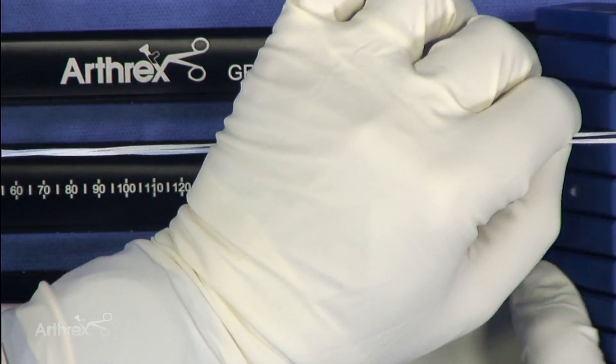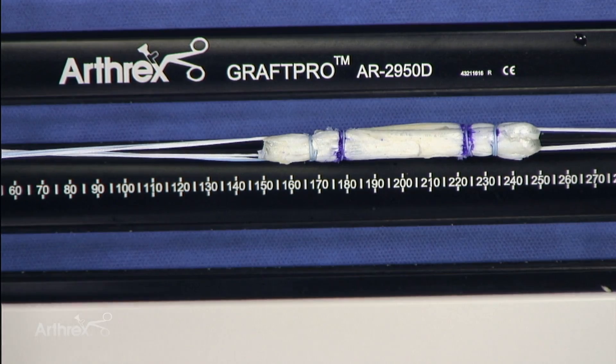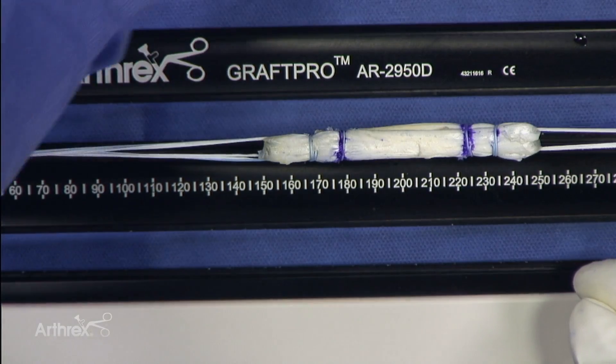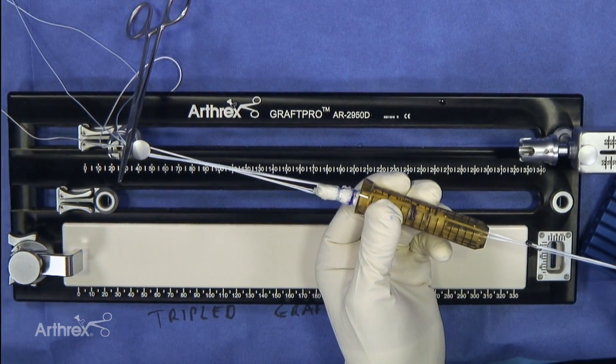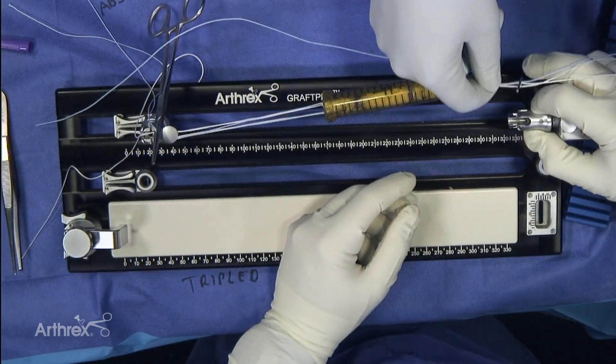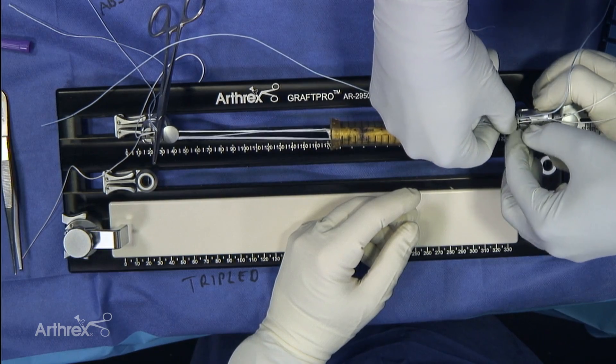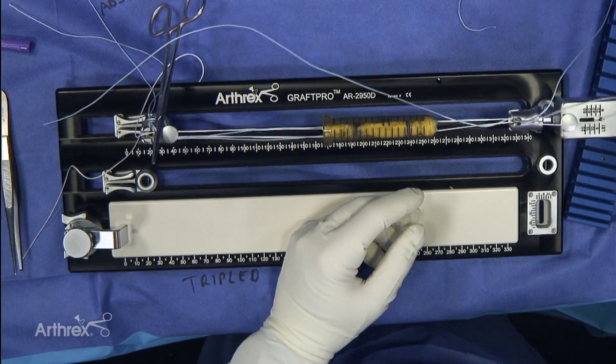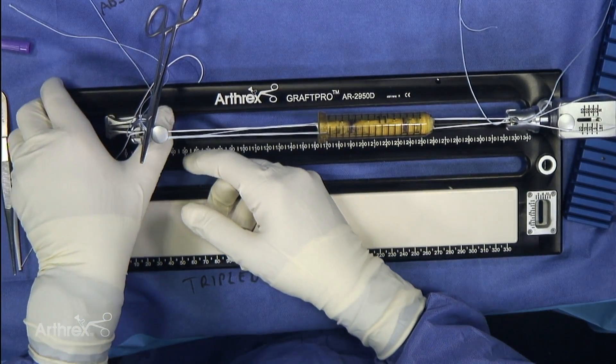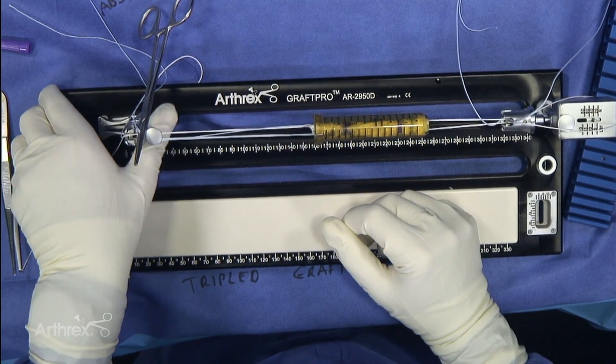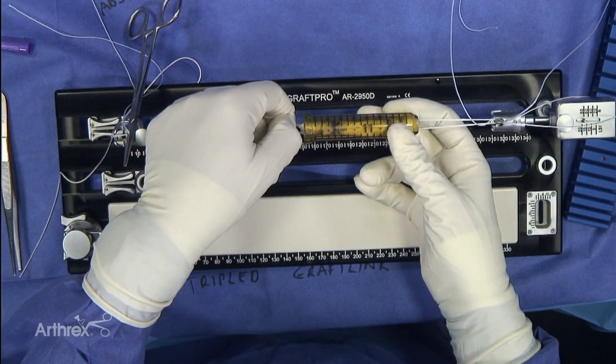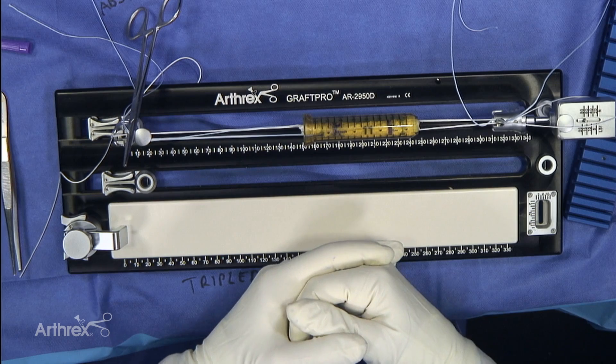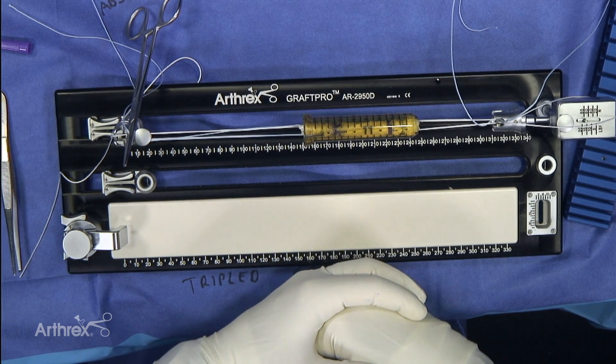Or you could try to create a nice uniform construct that's super smooth by using the Arthrex compression tubes. And now we're going to come through. Takes just a little bit of work. There we go. And then at this point you can just leave it. And so now we're going to just put the construct back into the holder. Now we'll get a little tension back. And it's beautifully tight. You can see the 11 right there. And now we prepare the knee and it'll be ready for graft insertion.